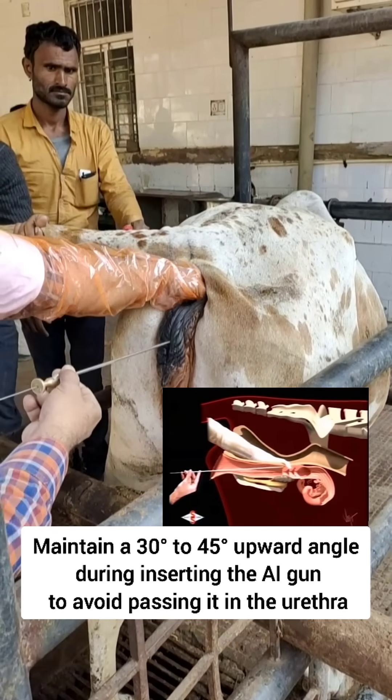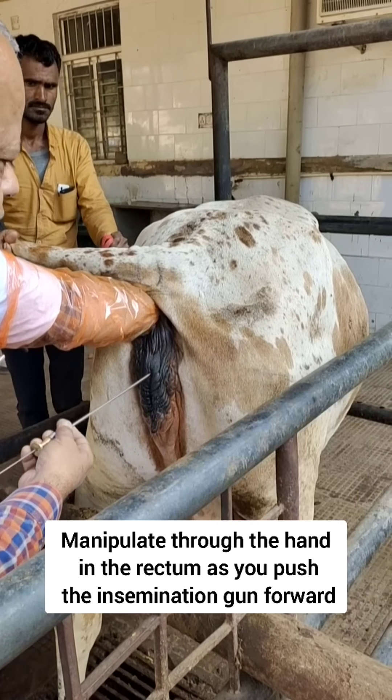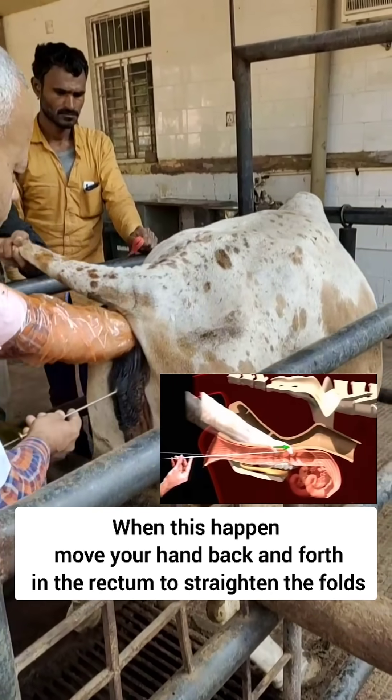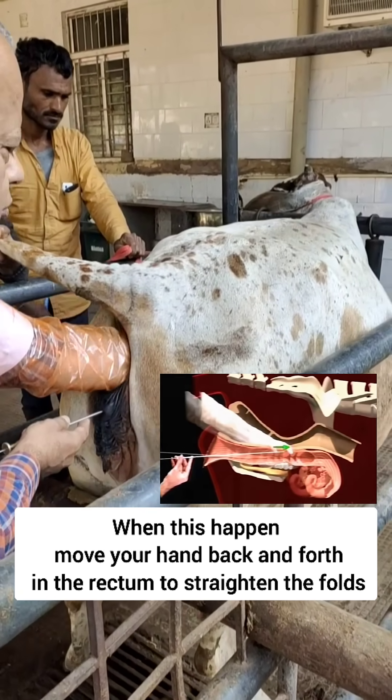Put your hand inside the rectum and through your hand in the rectum, guide the AI gun further. Sometimes the vaginal folds may obstruct the passage of the AI gun, so you push your hand back and forth and this will straighten the vaginal folds.